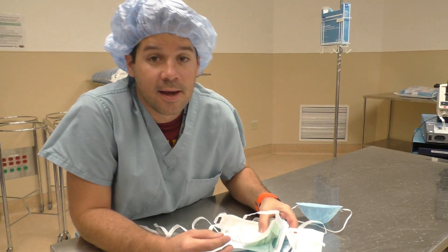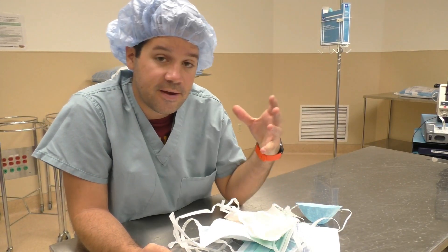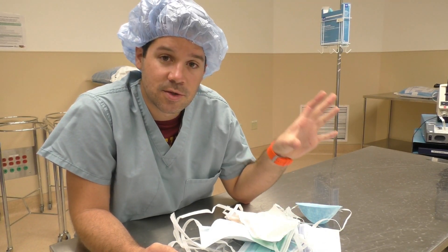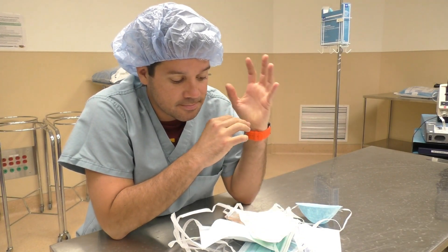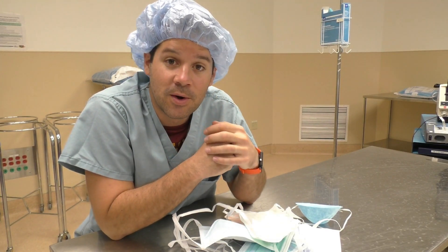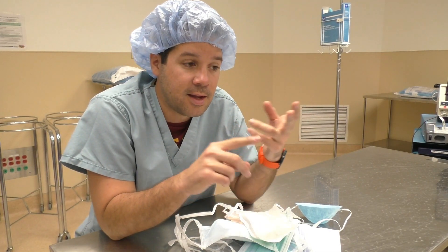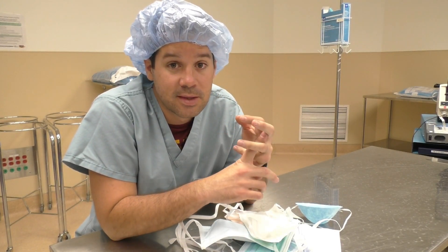Taking it back to the basics again today. One of the most important things you need to find what fits you in the OR is the surgical mask. Right next to the surgical glove, which is also very important. The mask is on your face all day long, so you've got to find what works, what fits well, what is non-abrasive to your skin, and what doesn't fog up your lenses.